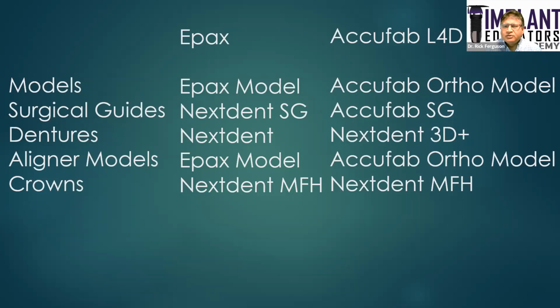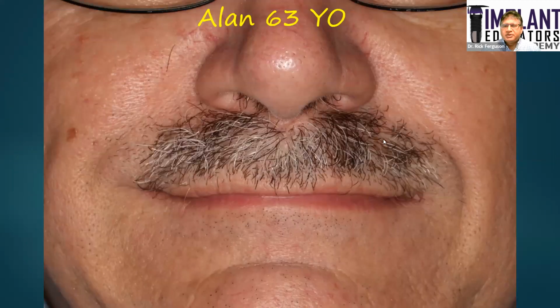Accufab, they have their own model resins, their own surgical guide resins, and they also do support NextDent, such as the MFH and their denture resin. So Accufab is the shining product, a new printer on the market.